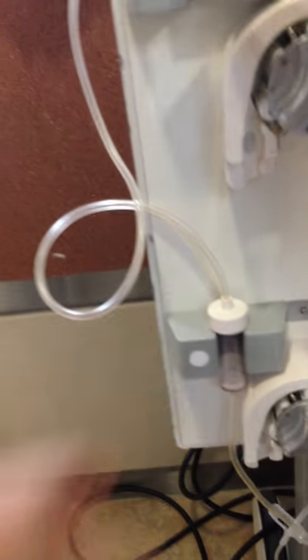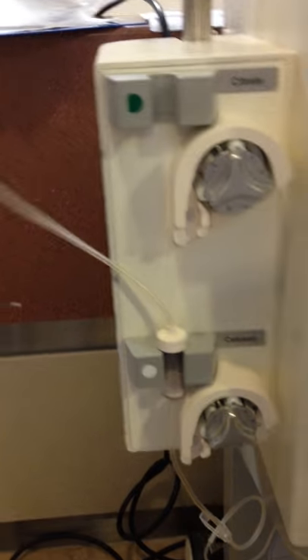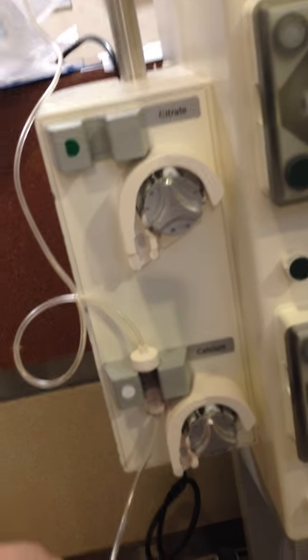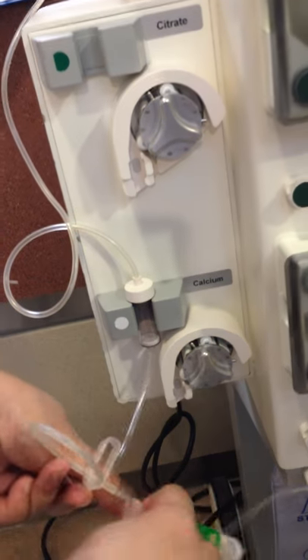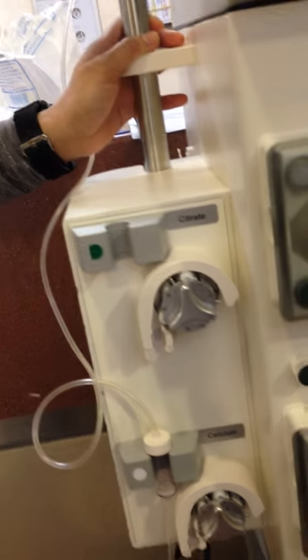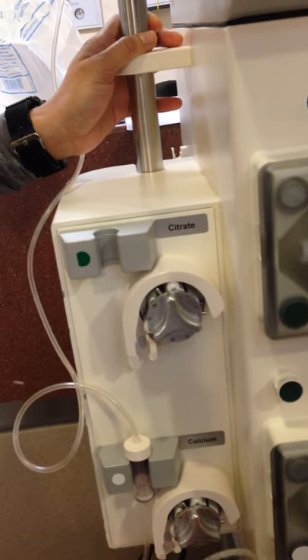Now, just to make you understand, what's in here is a drop sensor, or a drip sensor. Remember the old days, you have the drip, and it's being sensed how many drops are coming or going. All right, now next. Just a moment. Okay, install that.